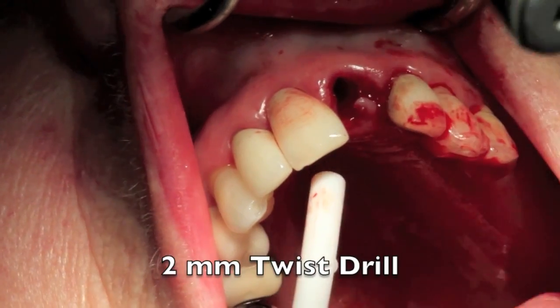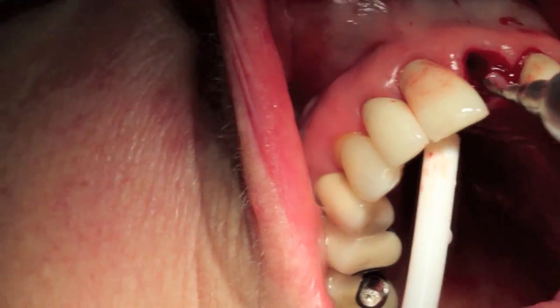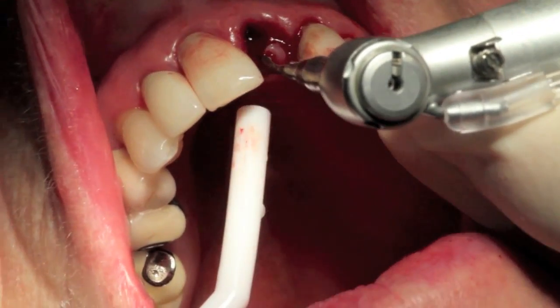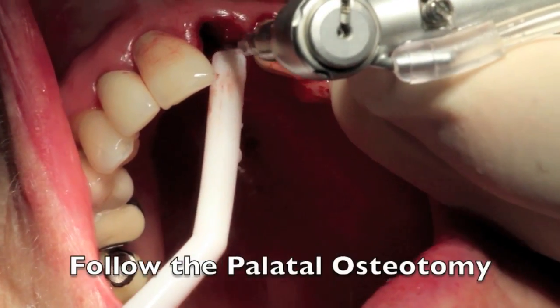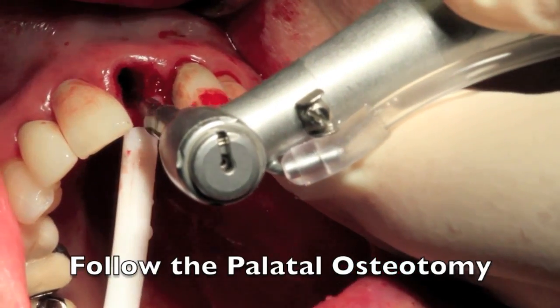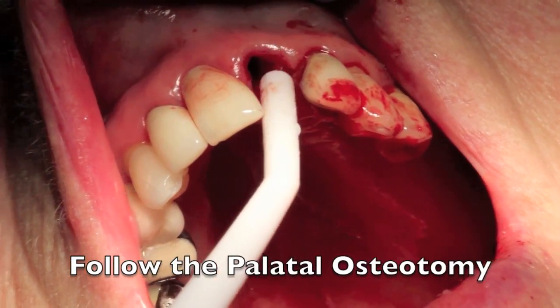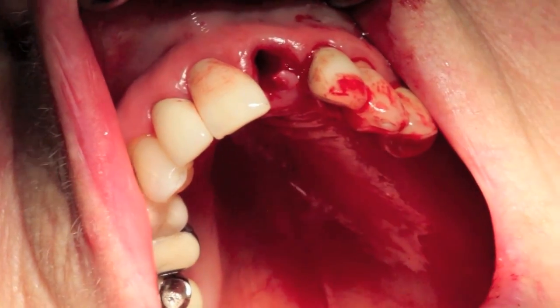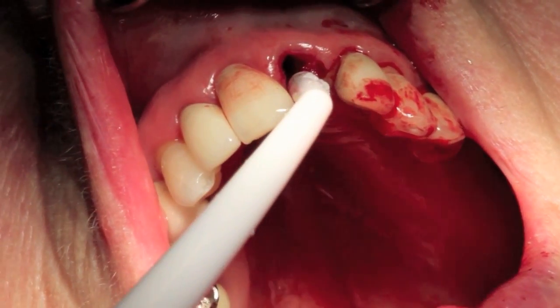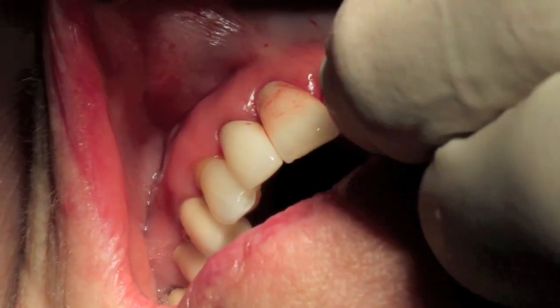So our next drill we're going to use is the 2mm twist drill, and we'll still follow this on an angle when we first start the osteotomy, just so we can engage that palatal wall, but it's very important to follow where that precision drill has just made that first start of the osteotomy. So we're following this in, making it a little bigger, and we're rotating as we go in, so we're pushing the bone a little bit at the same time as cutting it.